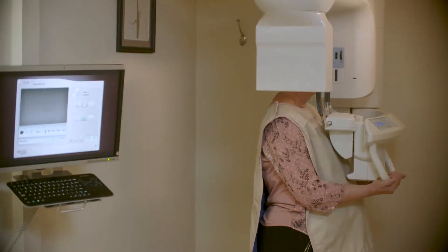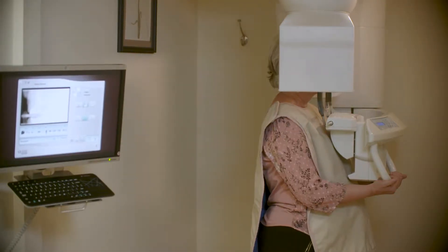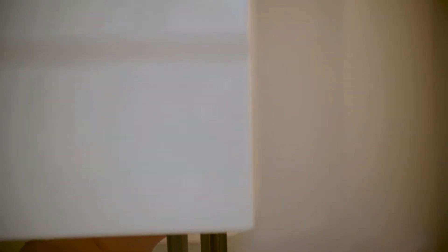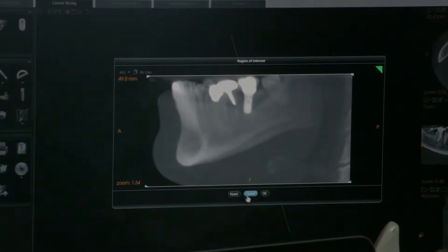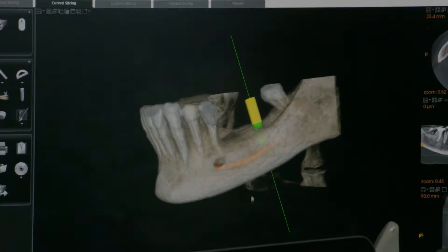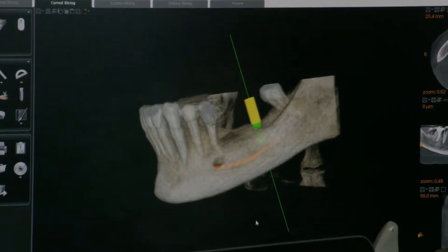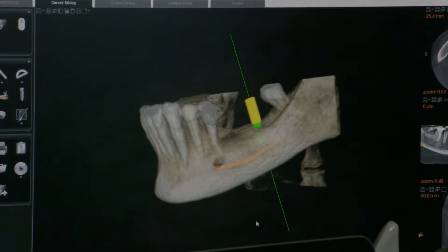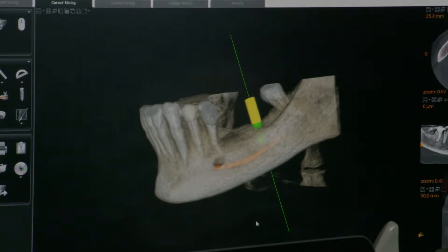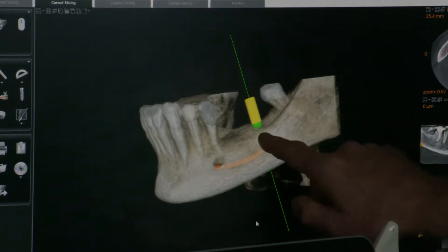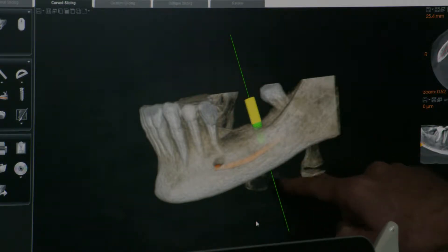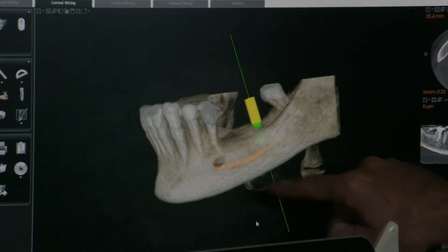First, we use a three-dimensional image called a cone beam scan that allows us to make cross-sections. We have the ability to see what the jaw looks like in three dimensions, and in this case we wanted to plan replacement teeth for the section where this yellow post is showing right now.